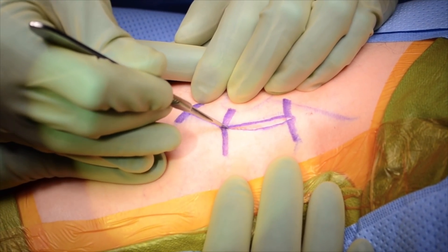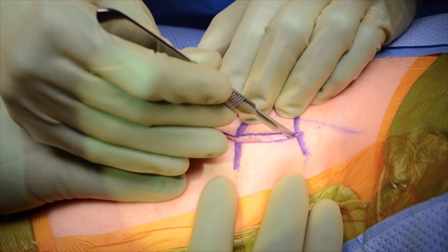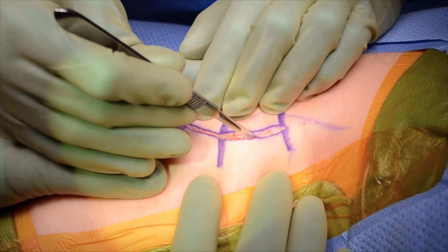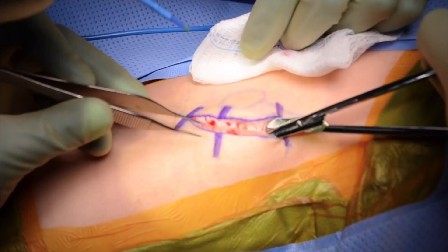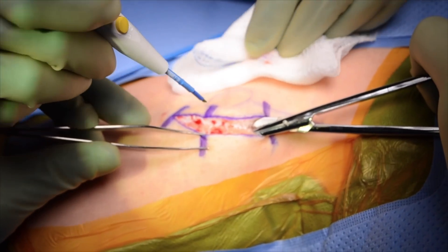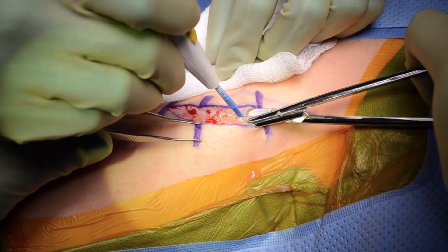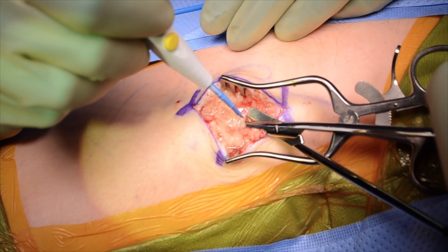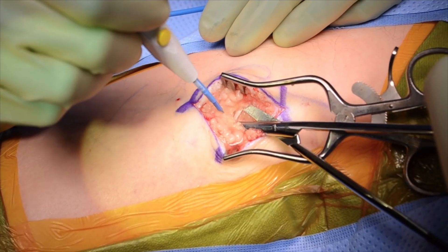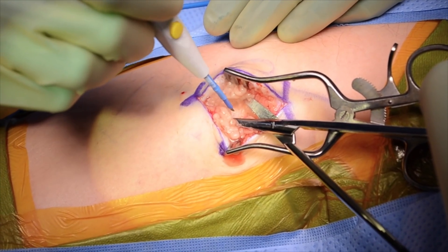The skin and dermis is sharply opened with a 15 blade, exposing subcutaneous fat. Dissection is carried through this layer using Metzenbaum scissors to create a plane that is then elevated away to protect the nerve, and subsequently opened using bovie monopolar electrocautery.